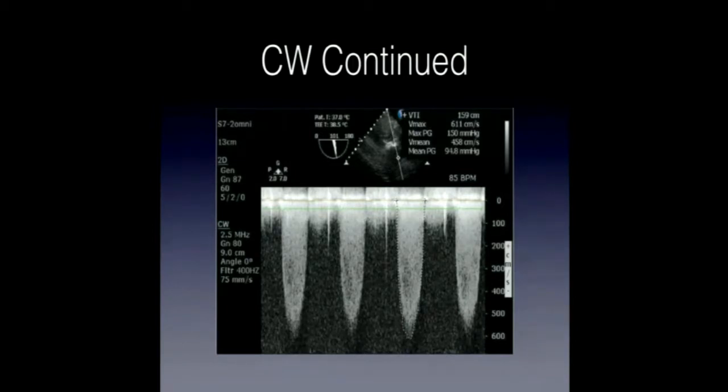These measurements are very severe. I've never had them that severe myself, thankfully, for not having to anesthetize a patient like that. But you can use those numbers. The mean is particularly useful for looking at the severity of aortic stenosis. So don't be afraid to do that with your transthoracic echo, which I'll get to in a moment.